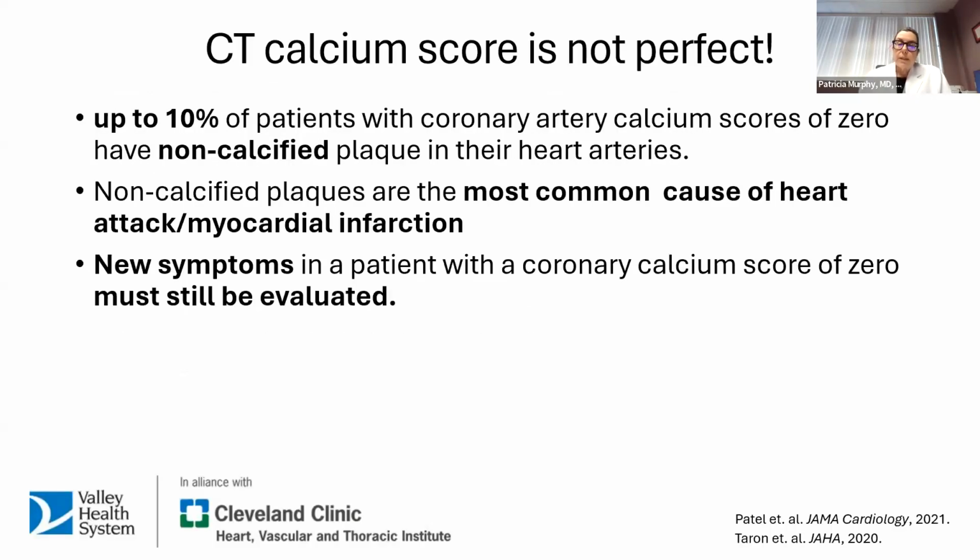Importantly, as I mentioned earlier, CT calcium scoring is not perfect, and up to 10% of patients who have coronary artery calcium scores of 0 have non-calcified plaque in their heart arteries. And that should come as no surprise. In a younger person whose plaque hasn't been there long, in whom healing has not yet occurred and calcium hasn't deposited, there is still a plaque. And non-calcified plaques, once again, are the most common cause of heart attacks and myocardial infarctions.